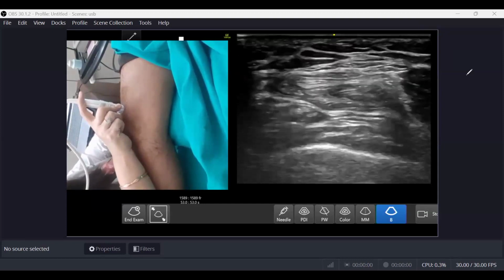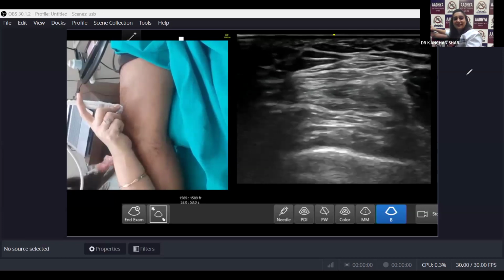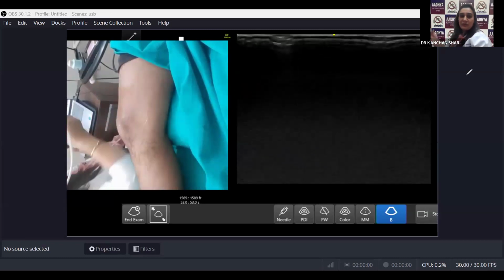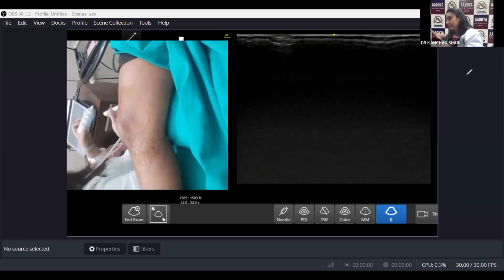Yes, I can see. So see, that is your fat pad, which means above that is going to be your suprapatellar recess. And then you wanted to know about the retinaculum? Yes, ma'am. Okay, one more time.